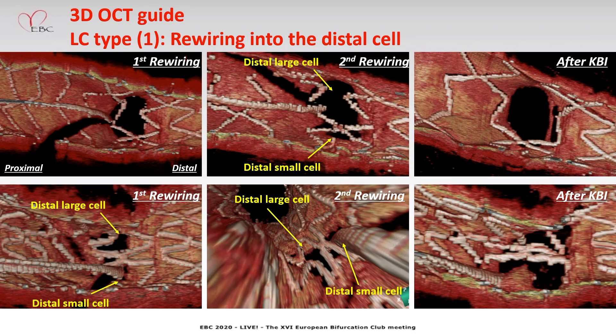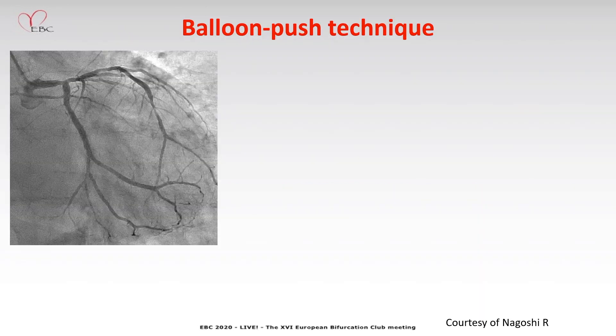These are the 3D OCT guidance cases in link-connecting type. In the upper case, here you can see link connection at the side branch ostium. We recrossed the guidewire in the larger cell. In the second attempt, we performed final kissing balloon inflation. Fortunately, wide opening was achieved; however, the link connection still remains at the center of the side branch ostium. In the lower case, guidewire recrossing into the distal smaller cell — we performed final kissing balloon inflation at high atmosphere; however, link connection still remains at the center of the side branch ostium. Another option is the balloon push technique.